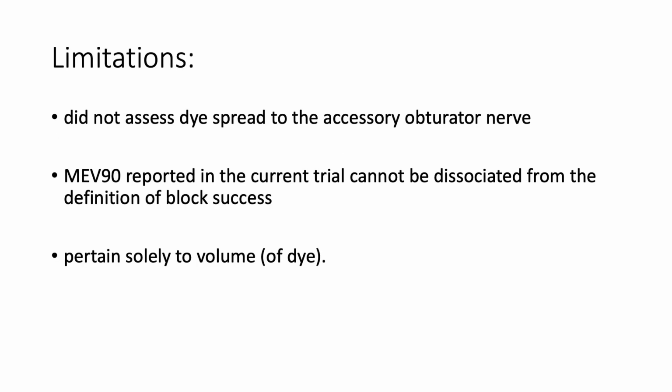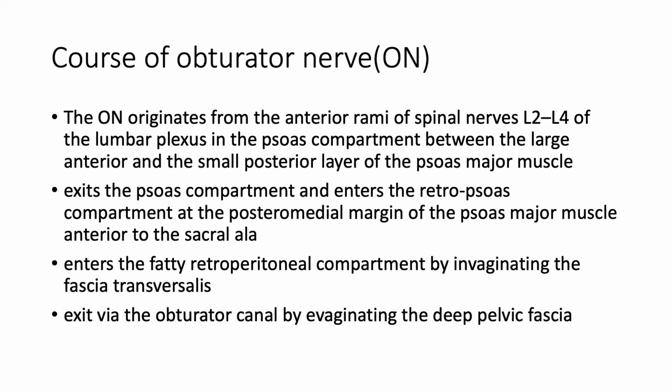The limitations of this research include that they did not assess the dye spread to the accessory obturator nerve. And the minimum effective volume reported in the current trial cannot be dissociated from the definition of block success. It pertains solely to the volume of dye because they did not study the viscosity of the solution.